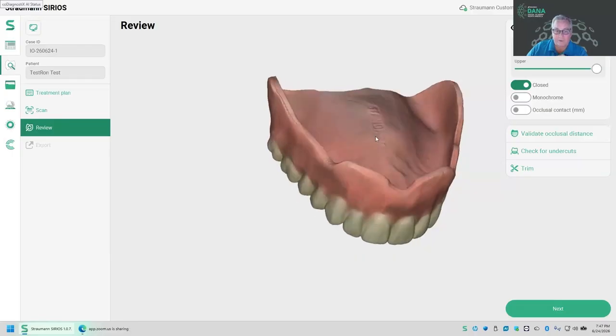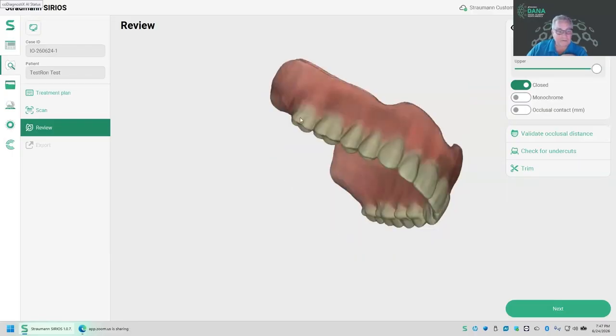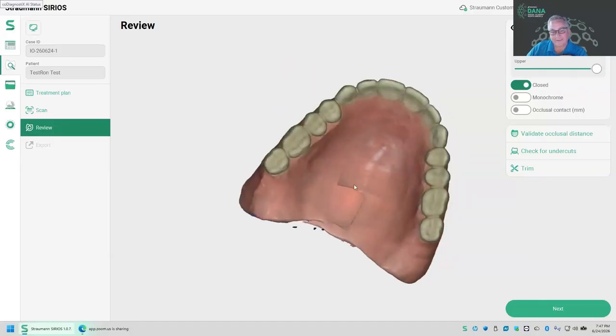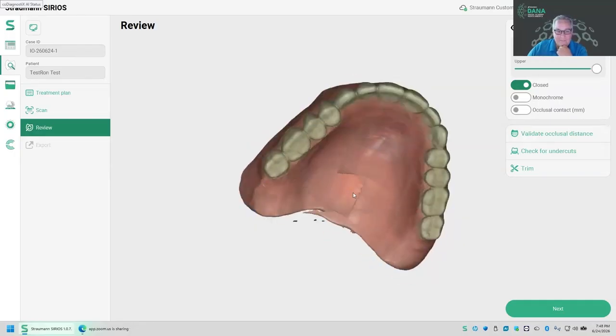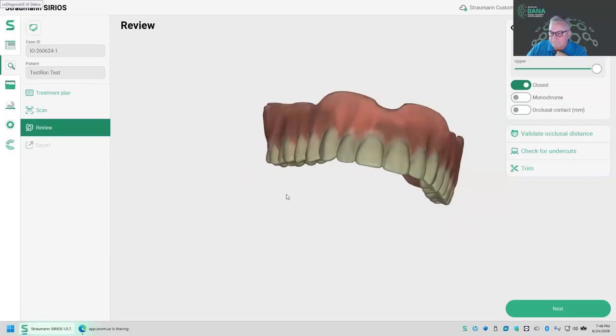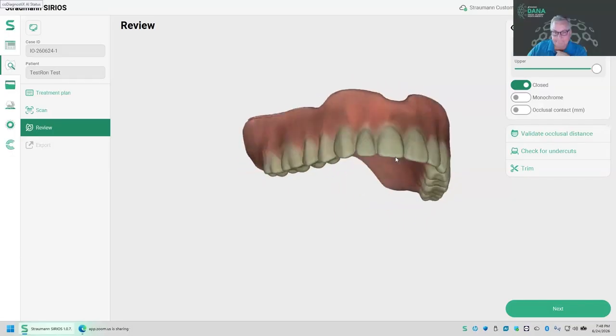I see too many people come around here, get to a tooth, and once they get to the tooth, they start going around. I'm like, no, you've got to build that entire flange before you start scanning the rest of the teeth. And by the time you get to this, I've maybe once or twice had a perfect palate here. And the time it takes to do that, it's not worth it, because the lab is not duplicating this. So I wouldn't spend too much time making the perfect palate scan. It's not worth it. Because the premise of this is that it is a reference denture with a wash impression inside of it, right?